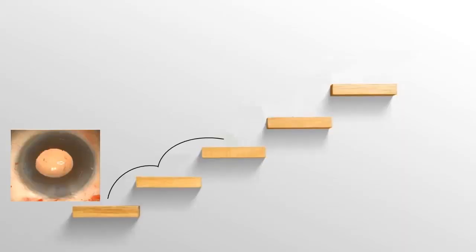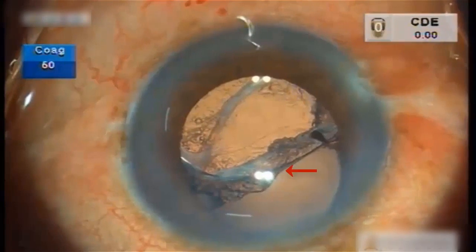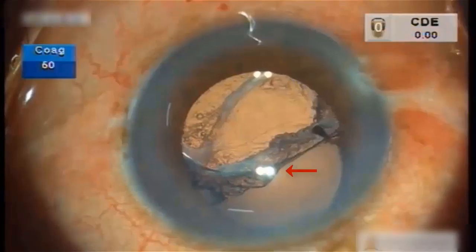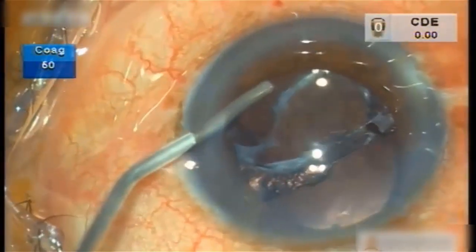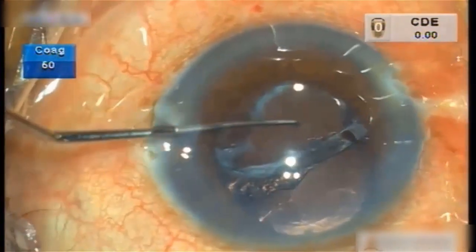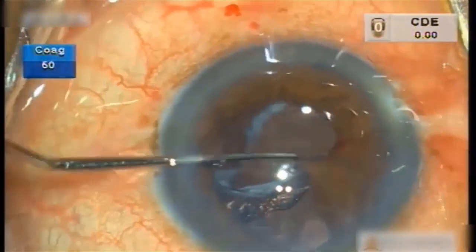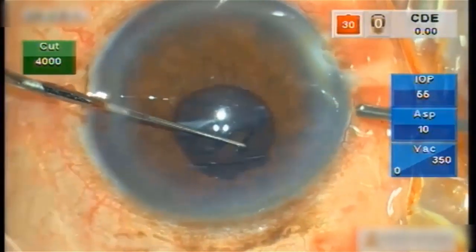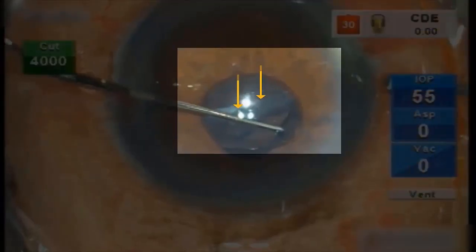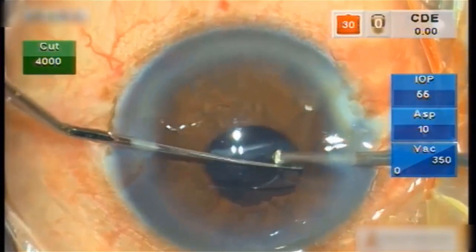There are various other indications for this technique as well. This is a case of late in-the-bag lens dislocation following ocular trauma, where an IOL explantation plus scleral fixation of the intraocular lens was planned — but we had other plans. Once the adhesions were released and mechanical constriction of the pupil was achieved, we planned for a single haptic fixation of the same intraocular lens. The intraocular lens was tilted and the fibrosed bag complex was removed centrally by doing an automated anterior vitrectomy.